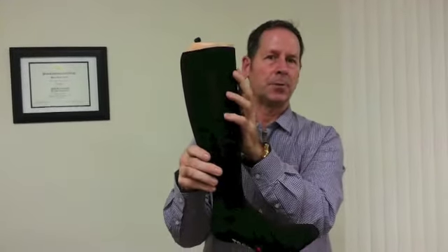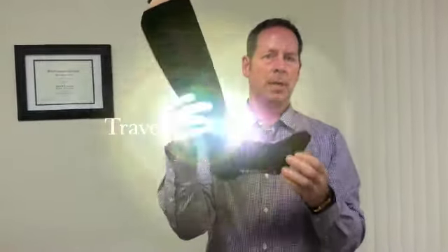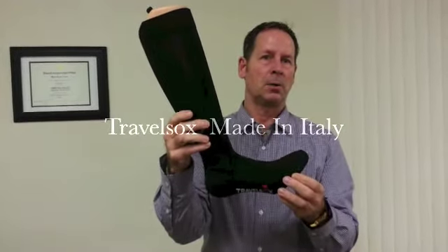It will help reduce varicose veins and keep your foot and leg looking wonderful. It's a great price, it's got a lot of features, and it's probably the best selling sock we have.